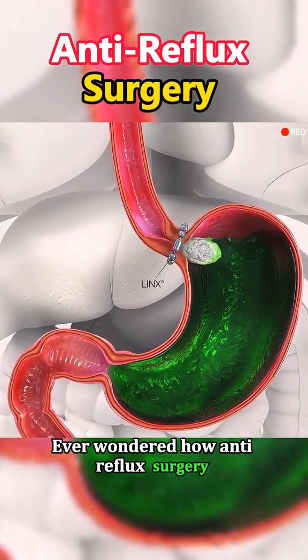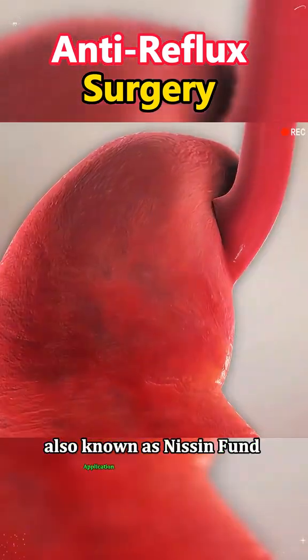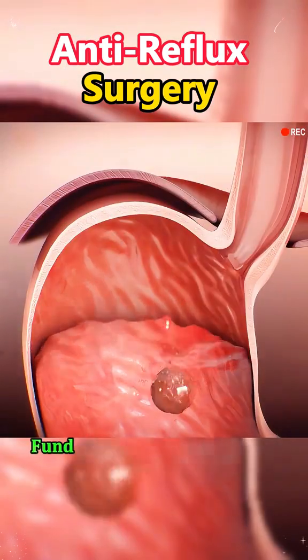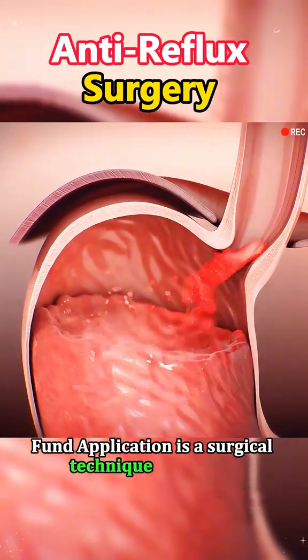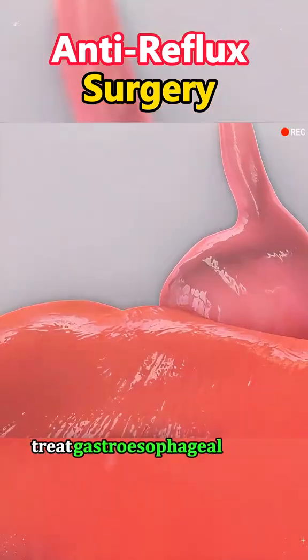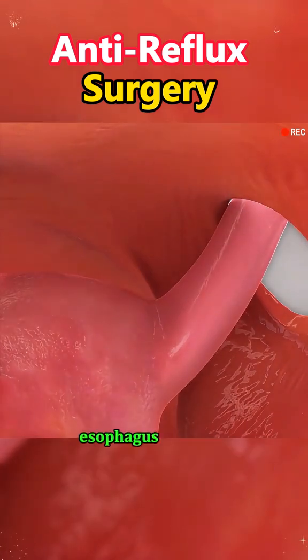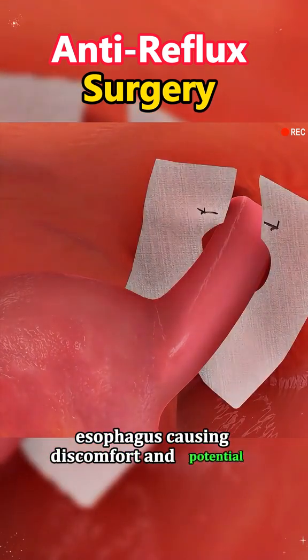Ever wondered how anti-reflux surgery, also known as Nissen fundoplication, is performed? Let's dive into the process. Nissen fundoplication is a surgical technique that helps treat gastroesophageal reflux disease, GERD, where stomach acid frequently backs up into the esophagus, causing discomfort and potential damage.